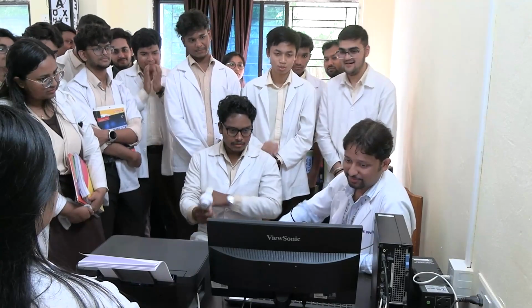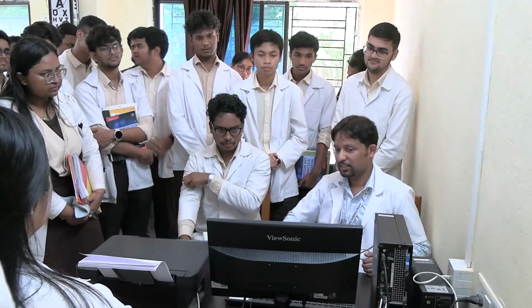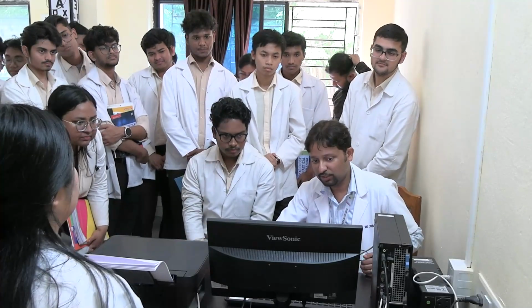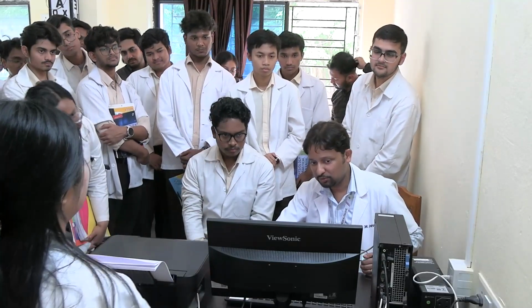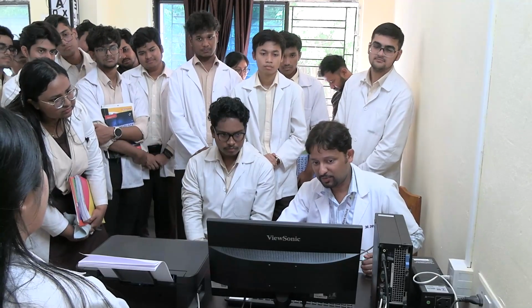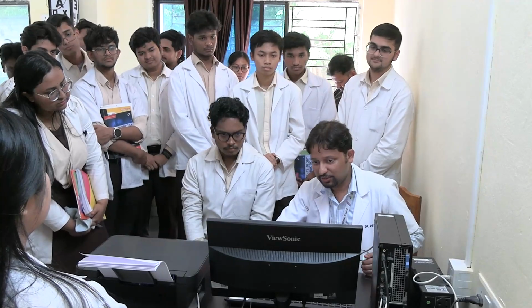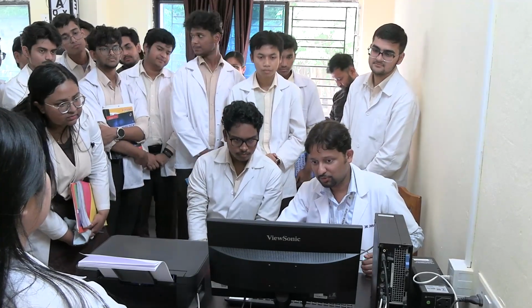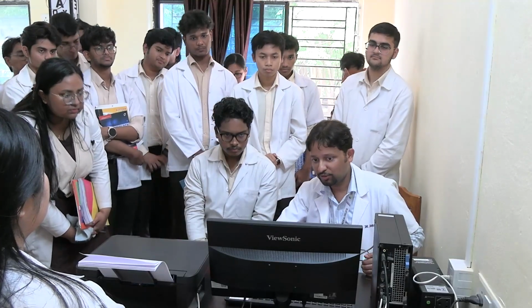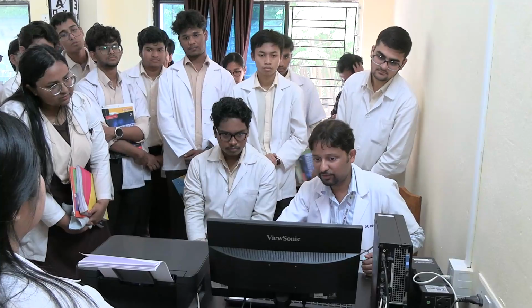It's not good. So old maneuver is better, so we'll still accept. So we have 3 maneuvers now. Okay. So maneuver 2 was the best one. This is maneuver 1, which is not acceptable. Maneuver 2 was good. Morphology wise, it was the most accurate one. And this is maneuver 3. So if you compare all the 3 together, you can also have it here together. So maneuver 2, the one in the blue, as you can see, this is the best one. So for this subject, we'll record maneuver 2 as we'll save that.